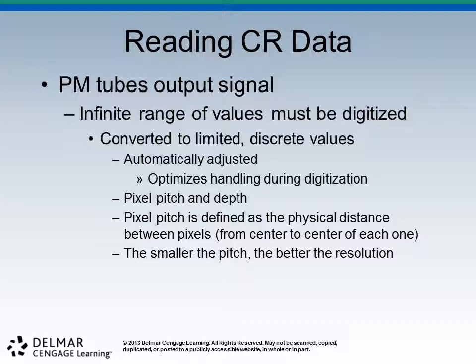All right. And then also on pixel pitch, the less that distance is, the better our resolution. And again, I don't know how many times I've said this. Just having a super high detailed radiograph is not enough. We've got to decide how much is too much, how much do we want to pay for and store. I know I sound like your father, but yeah, it's all money.